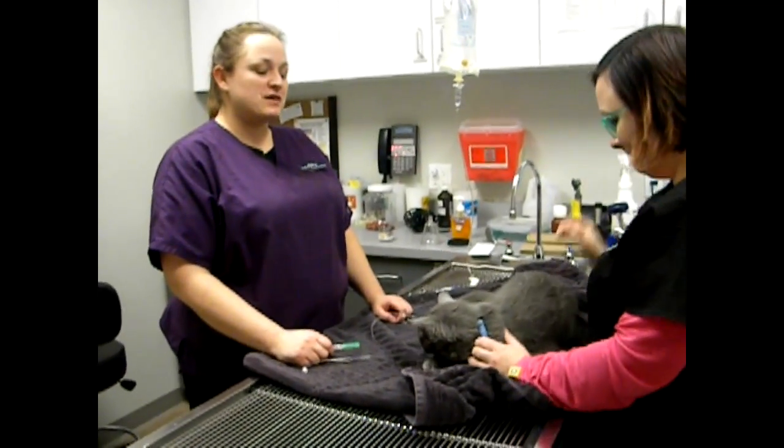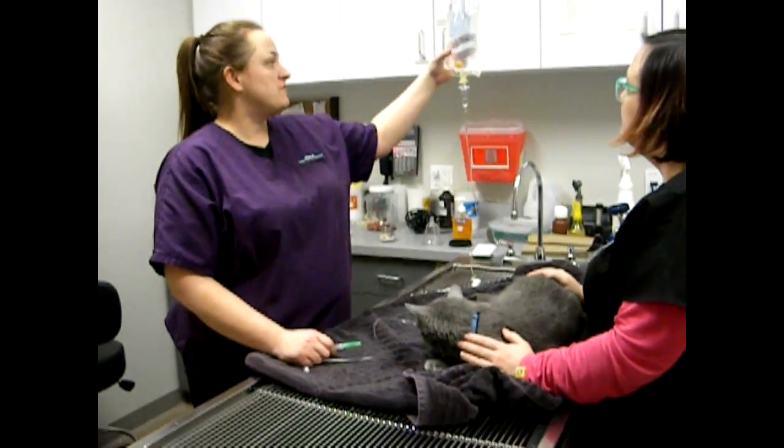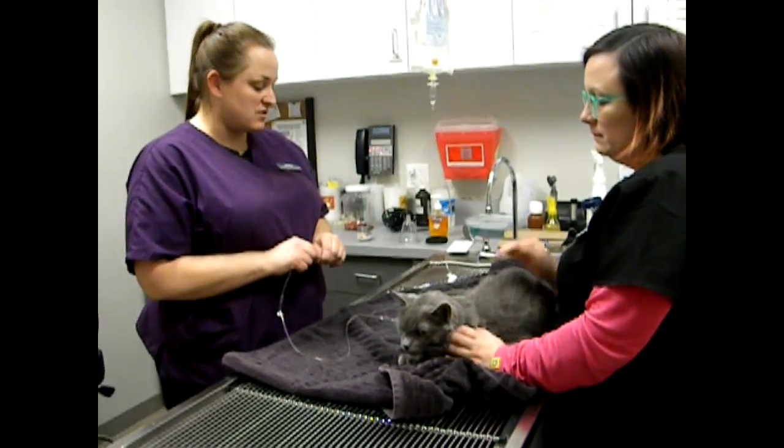This is Cash. We are giving him subcutaneous fluid, under the skin, 150 mL, with a new needle. His record has been checked and verified.